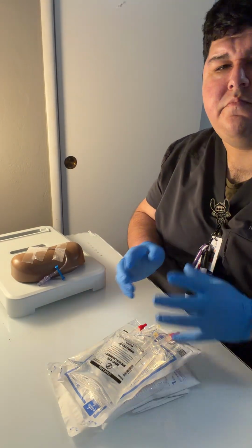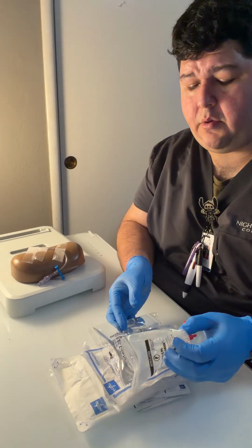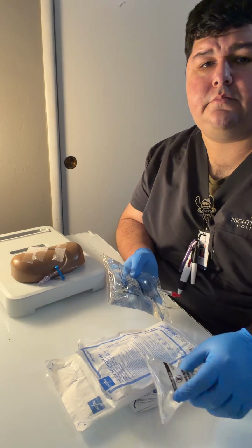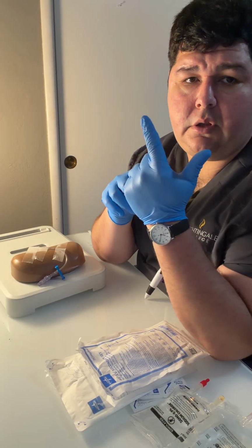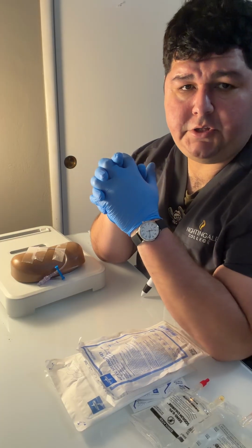All right, we have gathered our supplies. And then we have the primary fluid verified with the doctor's orders within the MAR. After that, we're going to verify the 5 rights of medication administration, which is the right patient, the right dose, the right time, the right route, and then the right documentation.